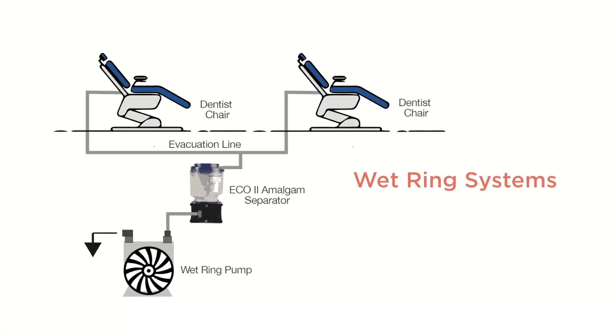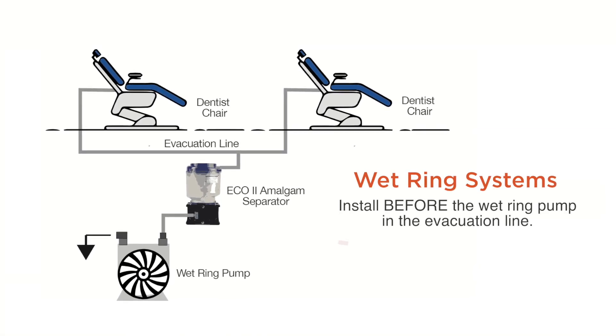For wet ring systems, the Eco2 should be installed before the wet ring pump in the evacuation line.